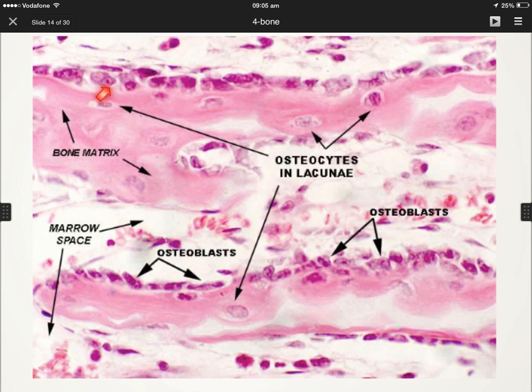And once they are imprisoned in rooms called lacunae in the bony trabeculae, they are called now osteocytes. So these are the osteocytes inside the bony trabeculae, and on the surface, the free cells are osteoblasts. One difference between this and that: this is less basophilic, that is more basophilic. This is not surrounded by matrix, this is surrounded by matrix. And this red area is the bony matrix here, which is formed, of course, of collagen type 1.